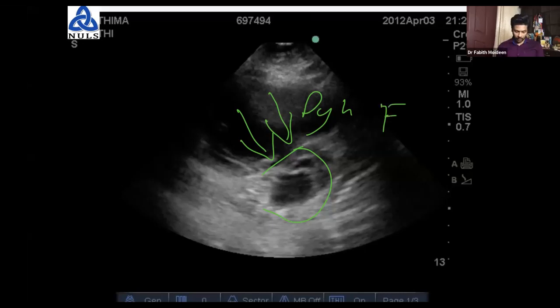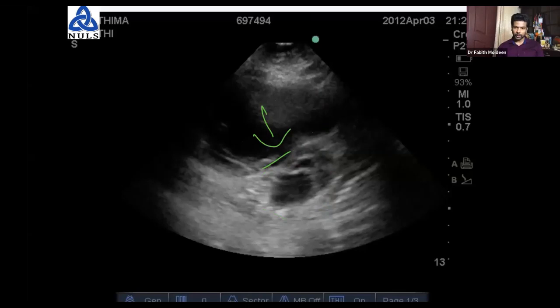Now, if it is happening during systole, if the septum is pushed during systole, you are probably dealing with pressure overload. Commonest is pulmonary embolism in that setting. Okay, I think this is clear.